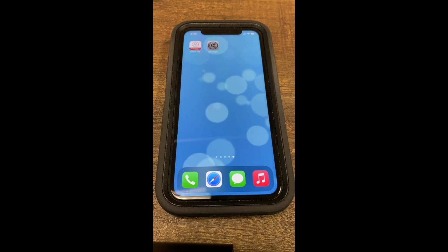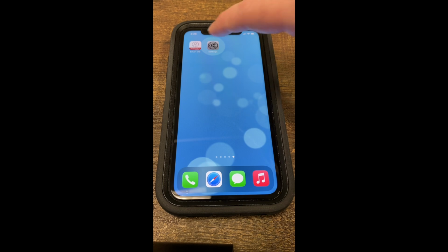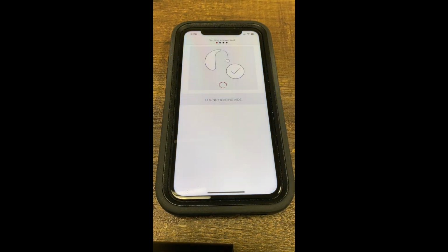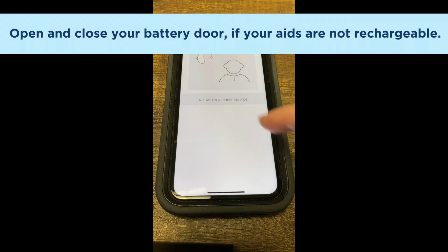The next step you'll want to take is go ahead and go into the Smart 3D app, and it'll ask you to turn the hearing aids off and back on again. So you want to press the Smart 3D app. It will find the hearing aids. Then it'll ask you to restart the hearing aids again.